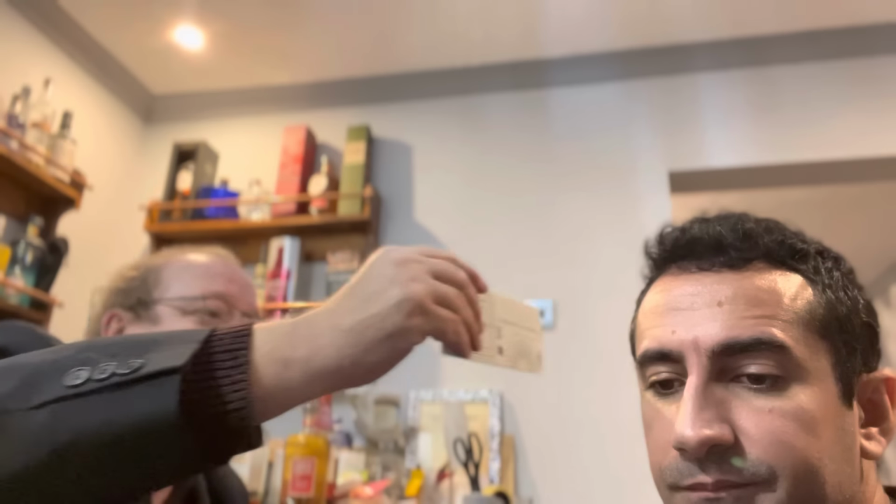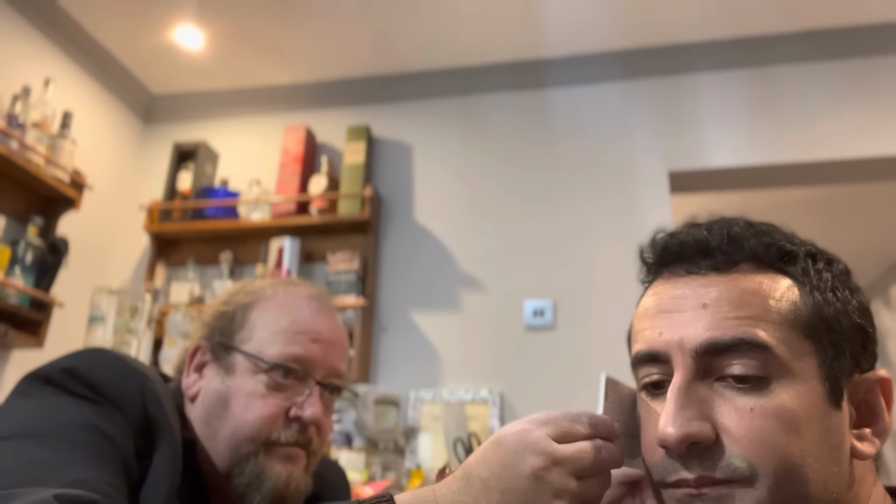The next measurement I want to do is length of side. Now we're doing this without having a pair of spectacles on. So to do this one, if you turn your head to the side for me, I'm going to put the nought level with your crest, and then what I'm looking at is the top of the ear, which is 125. I want it so that we've got the drop end, so I'm going to add about 15 mil onto that, so that's going to be 140 millimeters for the right.